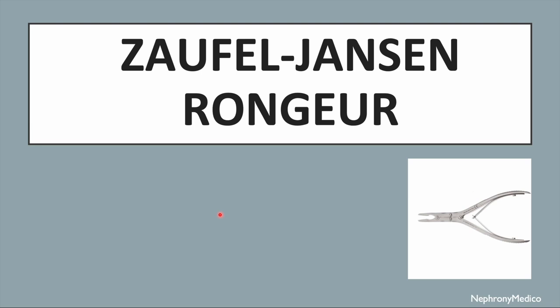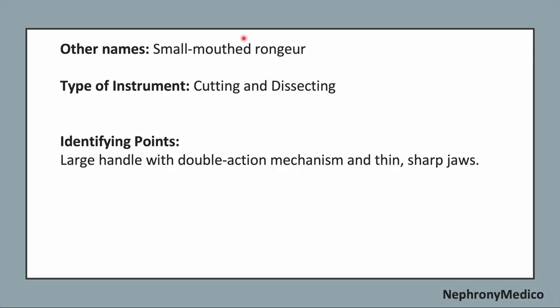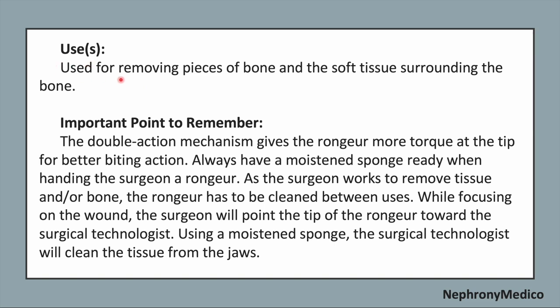Let's talk about Zaufel Jansen Rongeur. This is a picture showing Zaufel Jansen Rongeur. It is also known as small mouthed Rongeur. It is a cutting and dissecting type of instrument. Now, identifying points. The large handle with a double action mechanism and thin, sharp jaws. Use. It is used for removing pieces of the bone and soft tissue surrounding the bone.